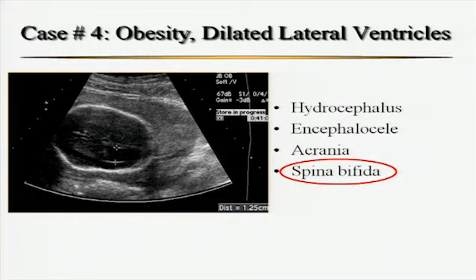So do your due diligence, make sure that you do roll the mom, try to get that baby to move away from the uterine wall. You need to be able to see amniotic fluid in between the uterine wall and the spine.